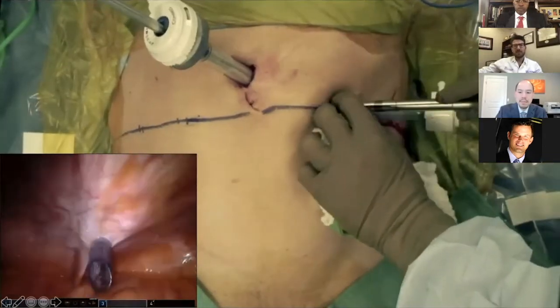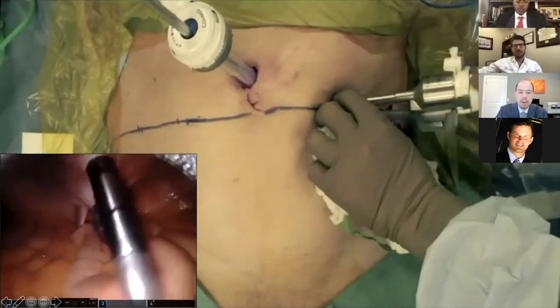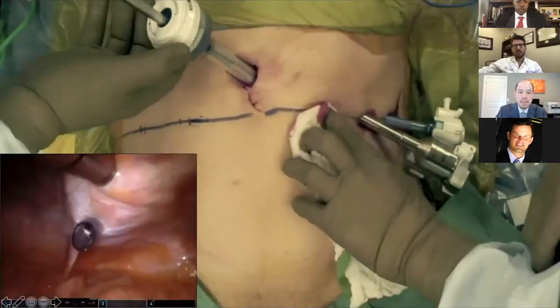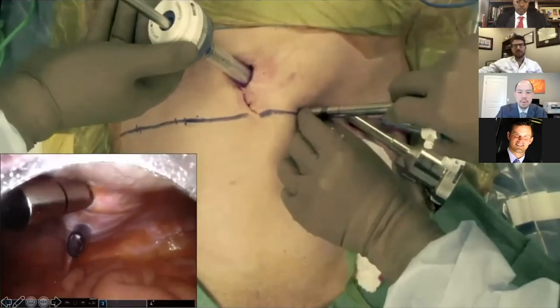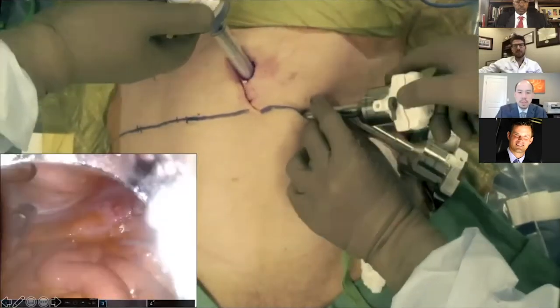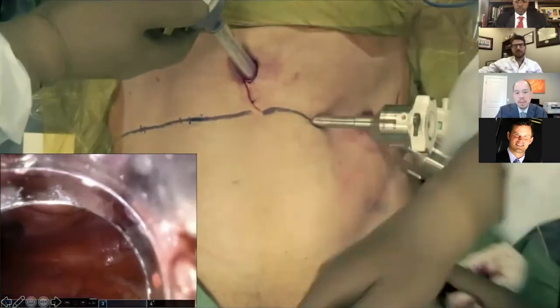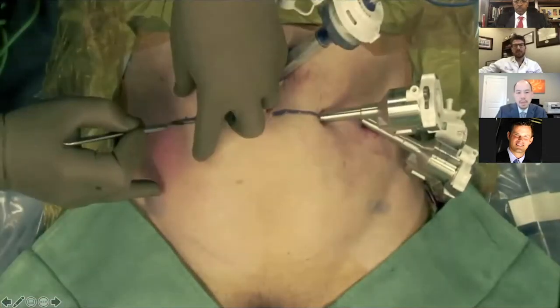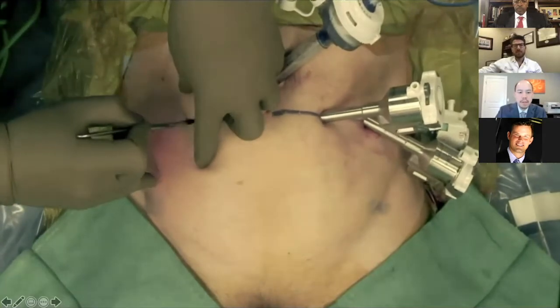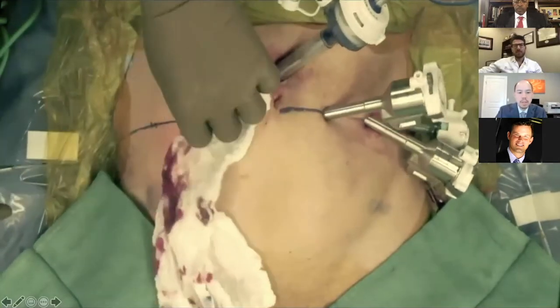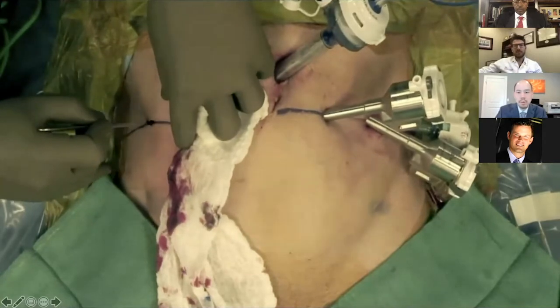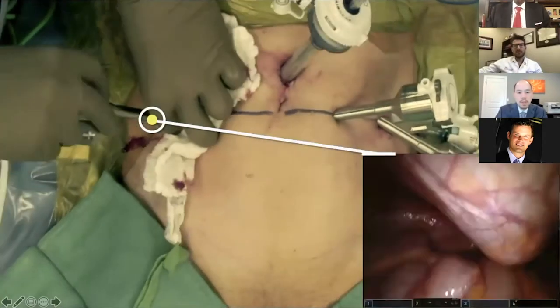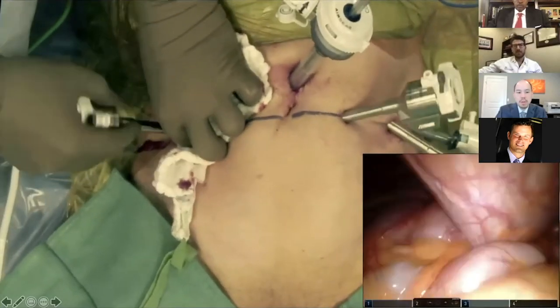I like to place the ports from a lateral to medial progression because this allows direct vision of each port as it passes. The first 8 millimeter port is the left-hand working arm port, and the port just off the midline to the left will be our future camera port. You'll see in subsequent videos that even though it's off midline, there's not much difference in the perspective.